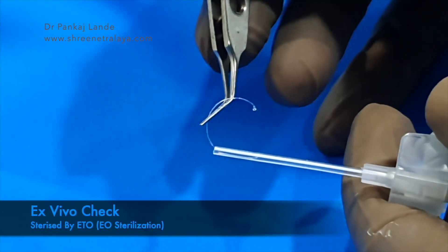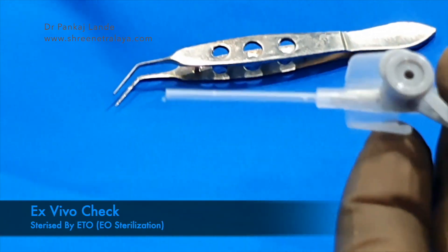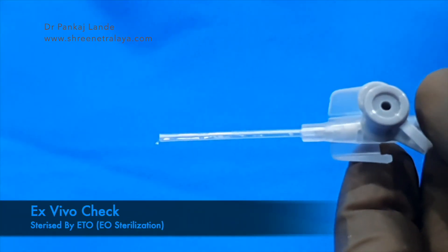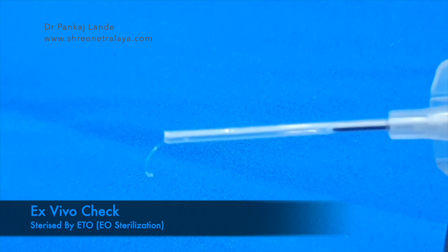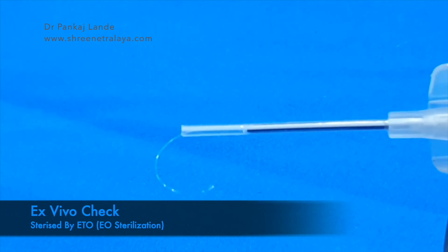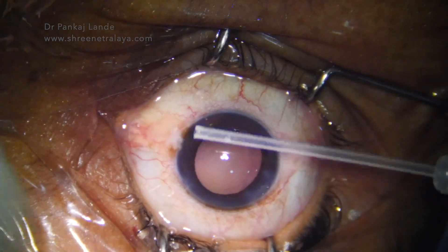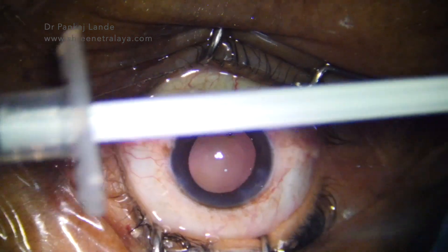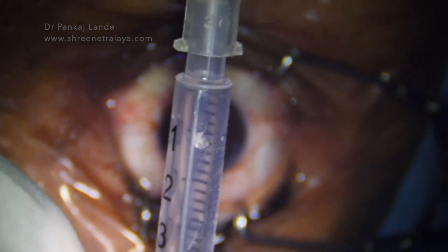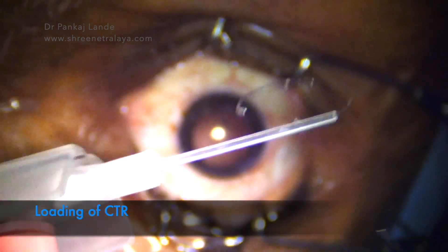Now we will do the final check. This system is sterilized using ETO after preparation. The CTR is loaded with the help of forceps and then injected into the anterior chamber — see how nicely and comfortably it comes out. With this system you need not manipulate with the left hand to manage the distal eyelet of the CTR. The front IV cannula can also be changed every time so that sterility is maintained. The air vent prevents air from the 1ml syringe from entering the anterior chamber.